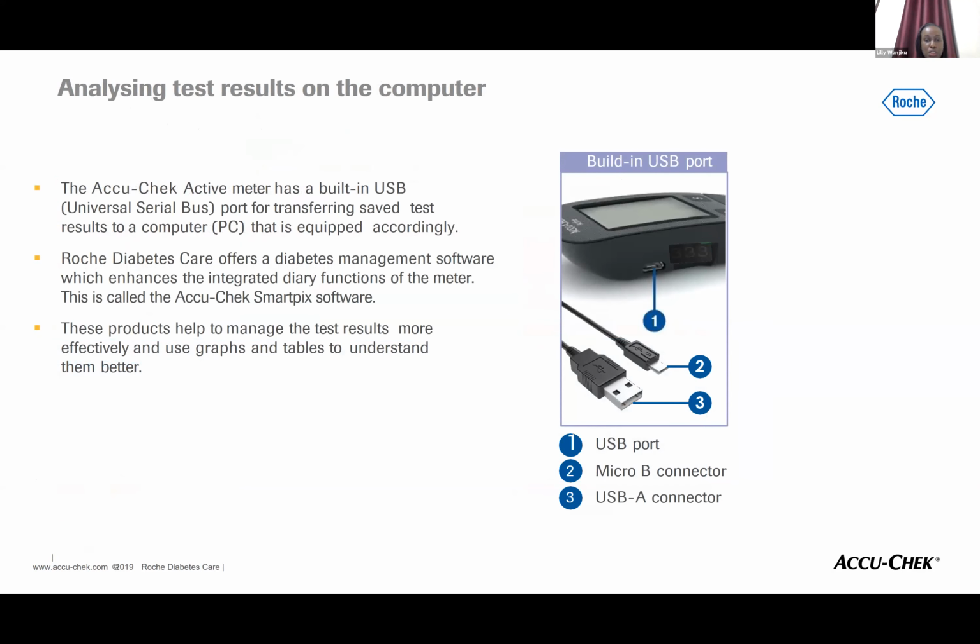Just to show you in terms of transferring data, the meter comes with a USB port. You can see the part labeled 1. That is where you plug in the USB cable, and data is transferred to a computer once the doctor has the Accu-Chek SmartPix software.